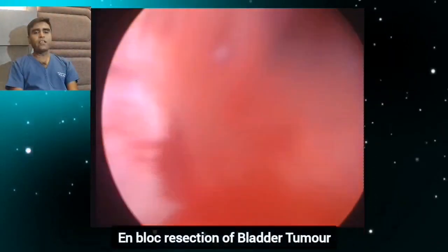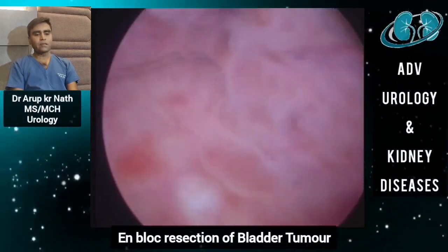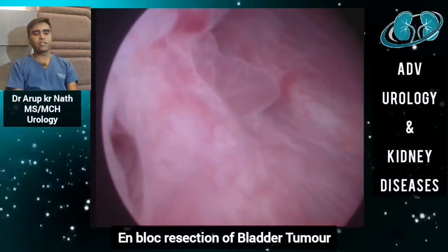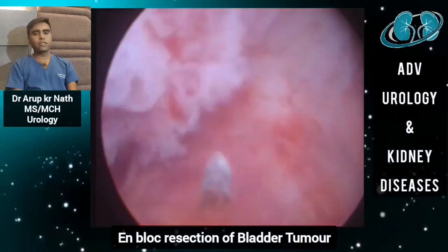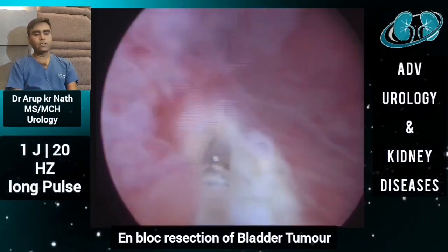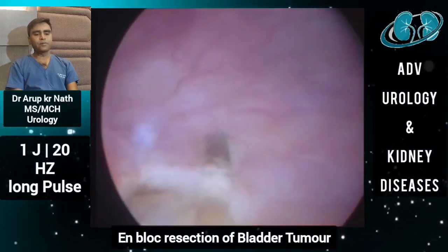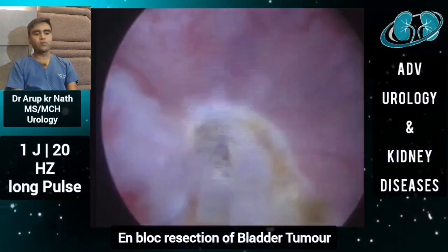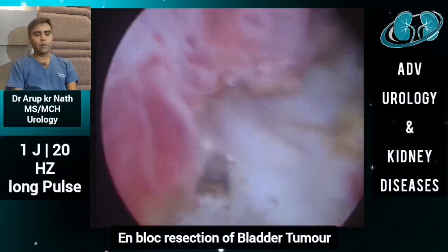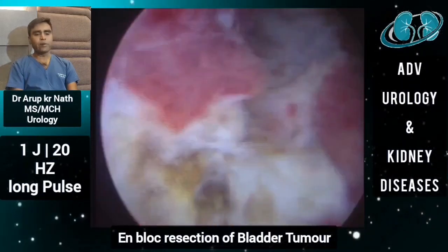Patient under spinal anesthesia in lithotomy position. On cystoscopy, you can see a polypoidal mass involving the right lateral wall of the urinary bladder, and here you can see the ureteric orifice — it is very close to the ureteric orifice. The energy was kept at 1 joule, 20 hertz with long pulse, and we are using a 600 micron fiber coming out of the laser working element through a 26 French Iglesias continuous irrigating sheath with a 30-degree cystoscope. We mark all around the visible tumor, 5 mm to 1 cm away from the visible tumor margin.